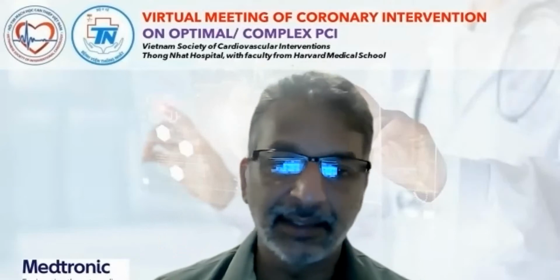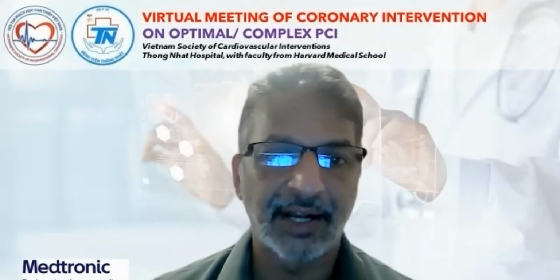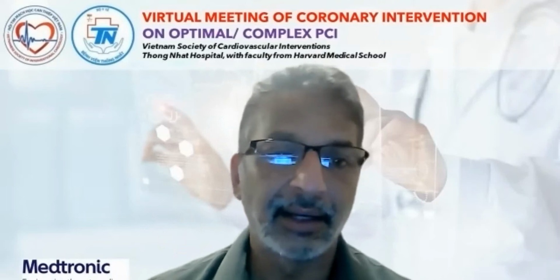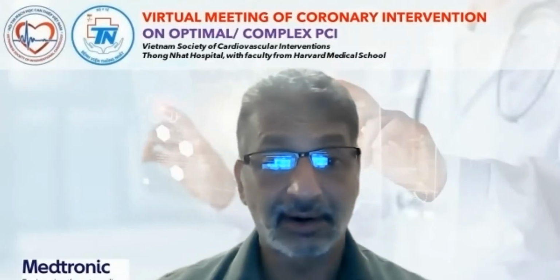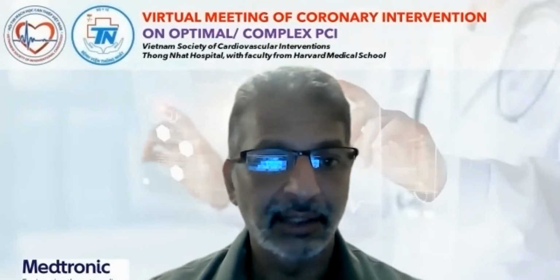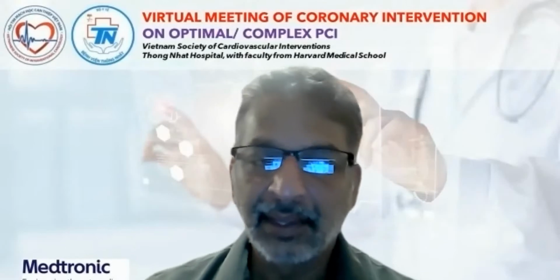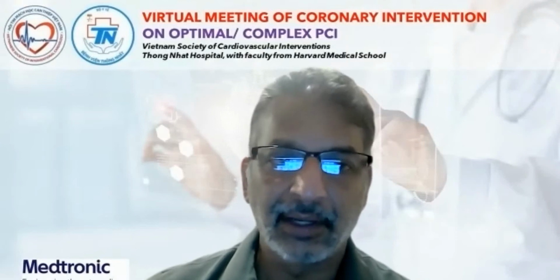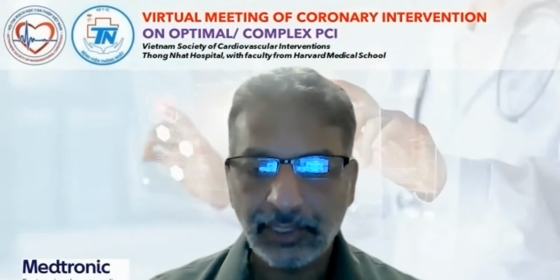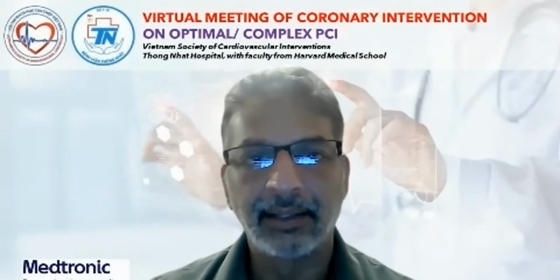And I tend to not use it simply because someone has a reduced ejection fraction and complex anatomy. They have to have some evidence that they are in heart failure, with elevated filling pressures and/or reduced cardiac output. And then if I'm going to use the Rotablator on a very extensive area, like in this case, the anterior wall, I will be more free about using an Impella.